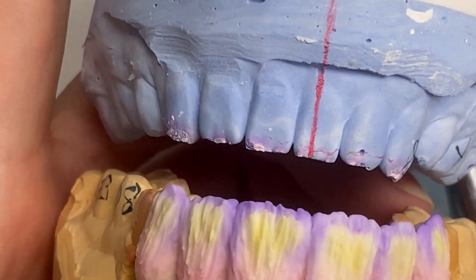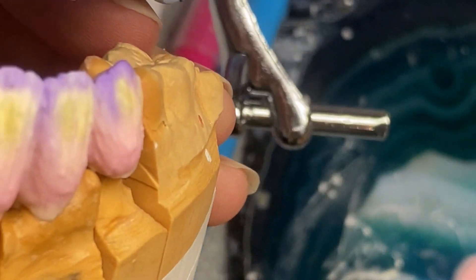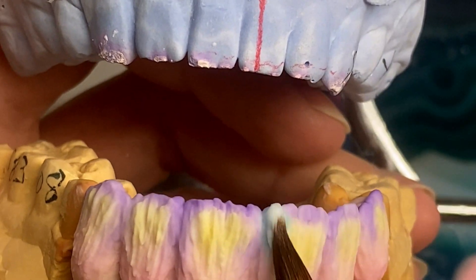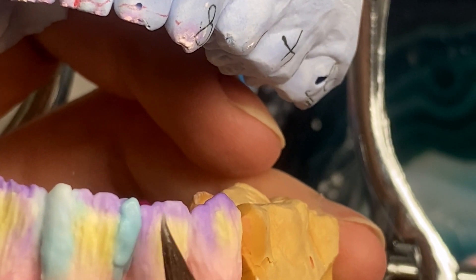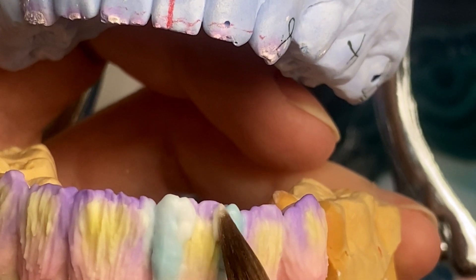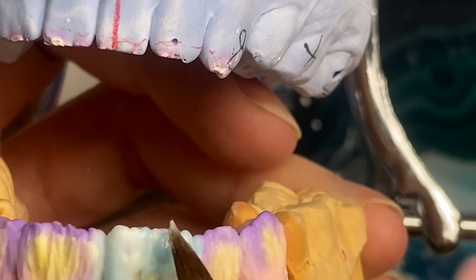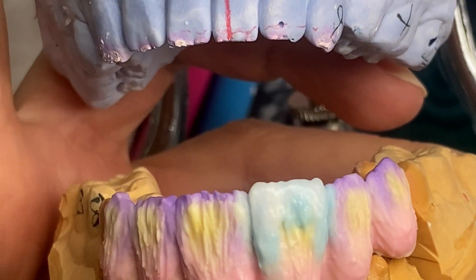Now this is done — let's layer the enamel. Enamel is enamel 59. It's not very translucent so I will layer it sectionally with the neutral enamel and enamel 59, and with this I'm gonna make my final shape. It just goes for the incisal third and then I apply it in.